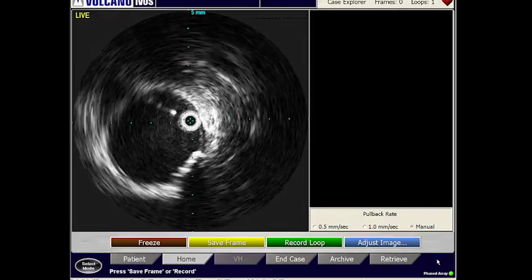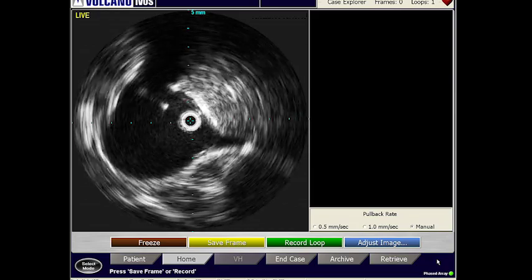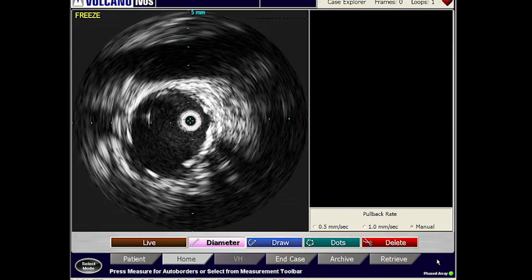Begin by measuring the diameter of the normal infrarenal aorta. For aneurysms with shorter necks, measure the diameter in the seal zone proximal to the aneurysm every 5 mm for at least 15 mm. For aneurysms with longer necks, measure at sites of obvious diameter changes. Continue taking measurements at the aortic bifurcation and down through the common iliac arteries. Using IVUS to measure normal aorta and aneurysm diameters can help confirm the measurements obtained on the pre-operative CT.